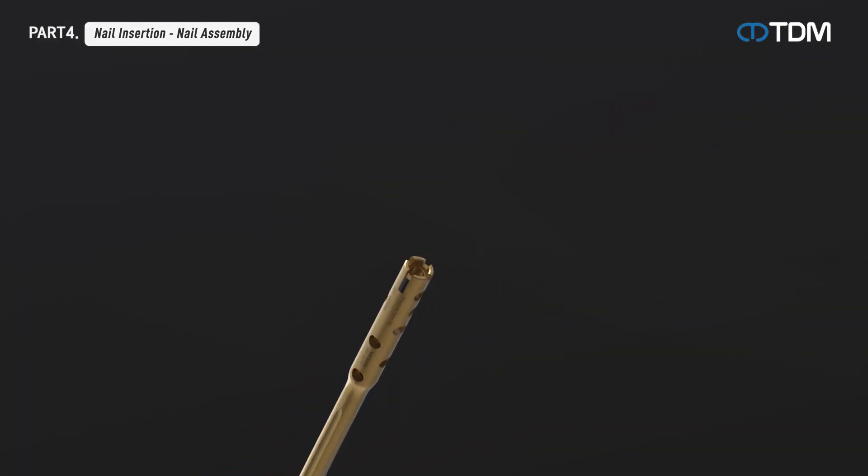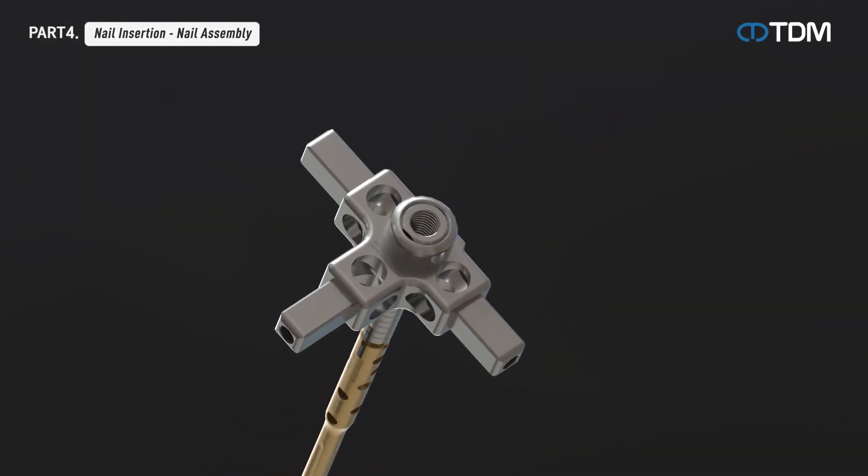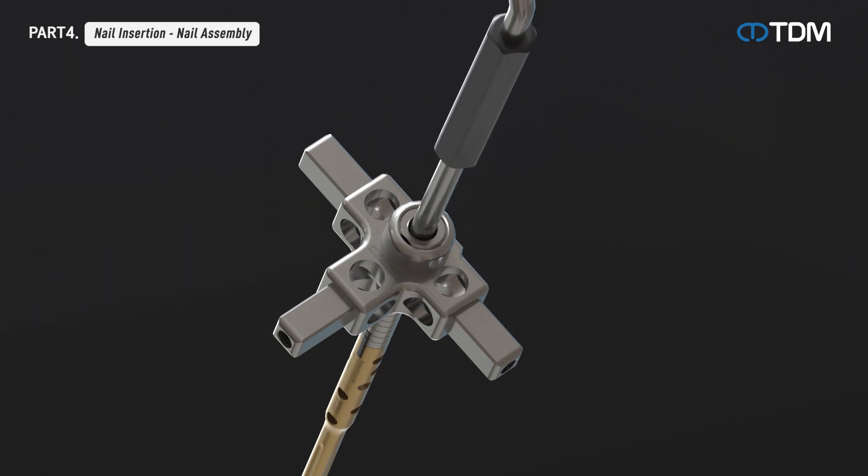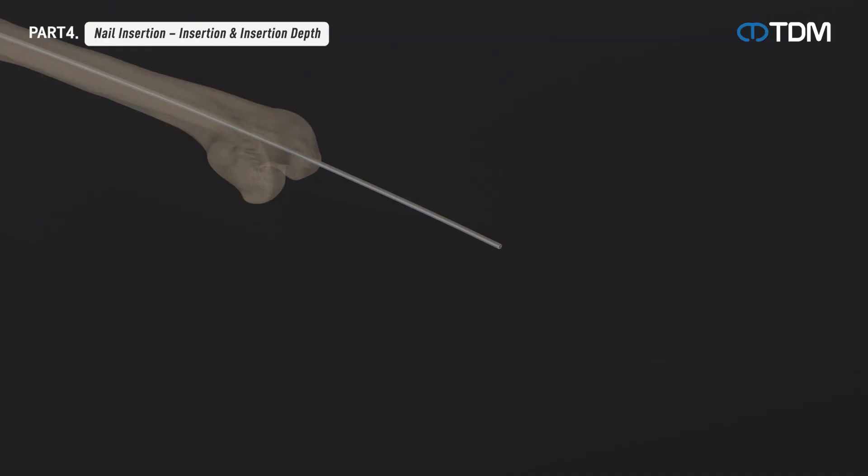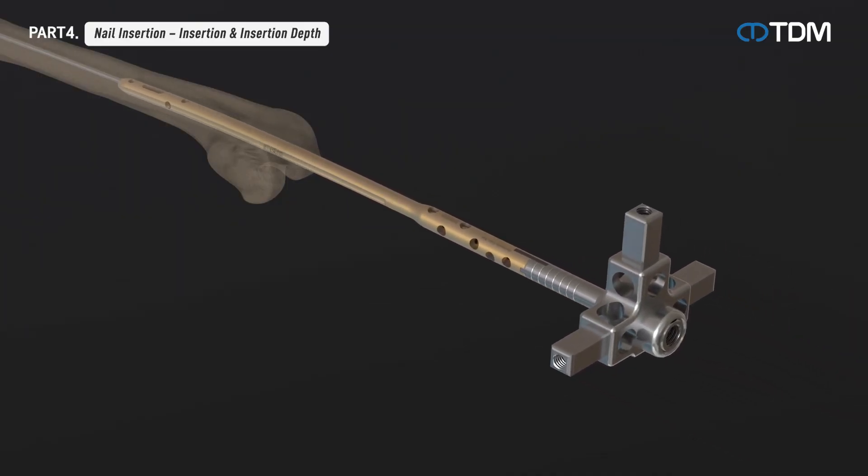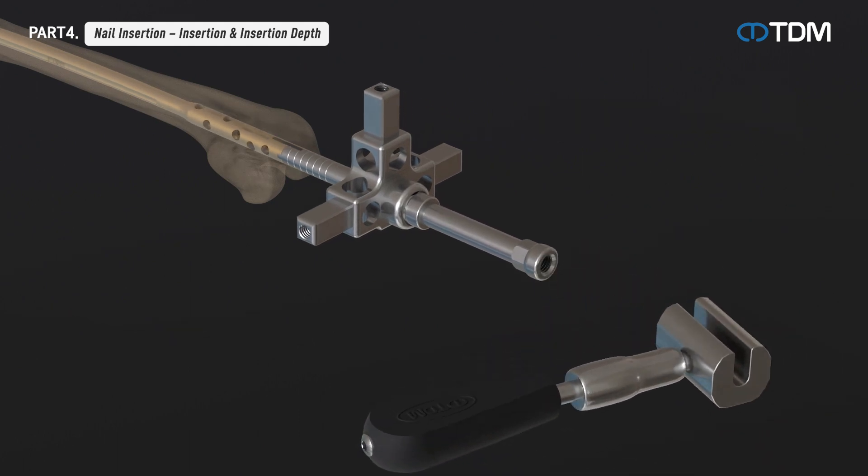Prepare a nail of appropriate length. Check the bending direction of the nail and combine the nail and the assembly handle in the correct direction with an assembly bolt. When the nail and assembly handle are combined, insert the nail along the reaming rod. Attach the impact handle to the assembly handle as necessary. Use light controlled hammer blows to seat the nail and insert it into the desired position.